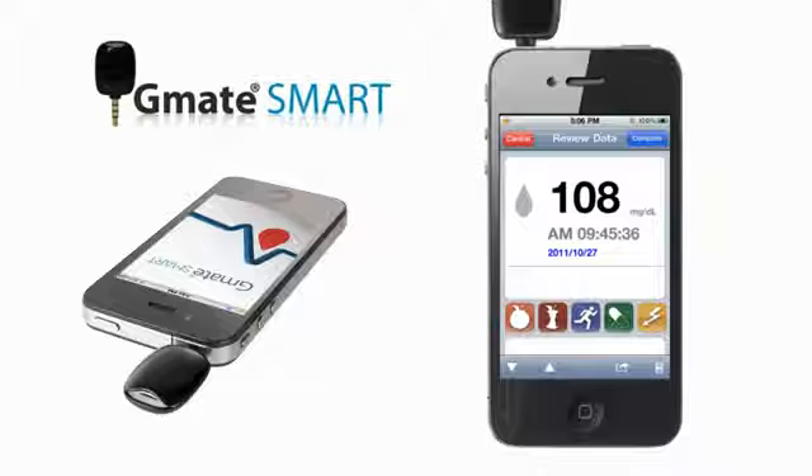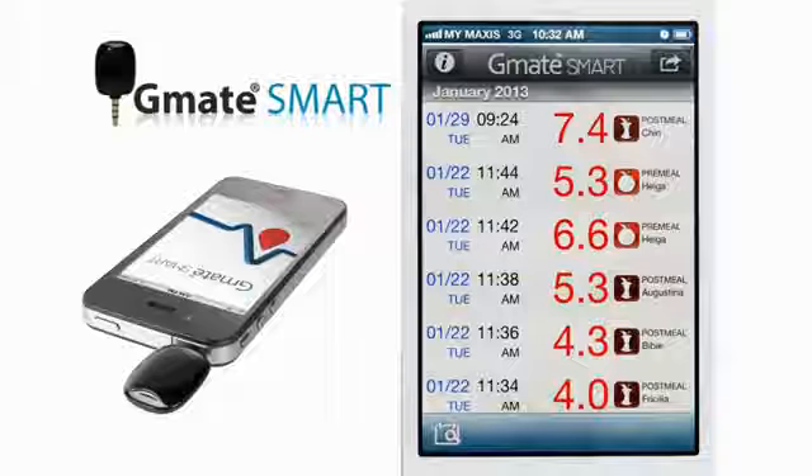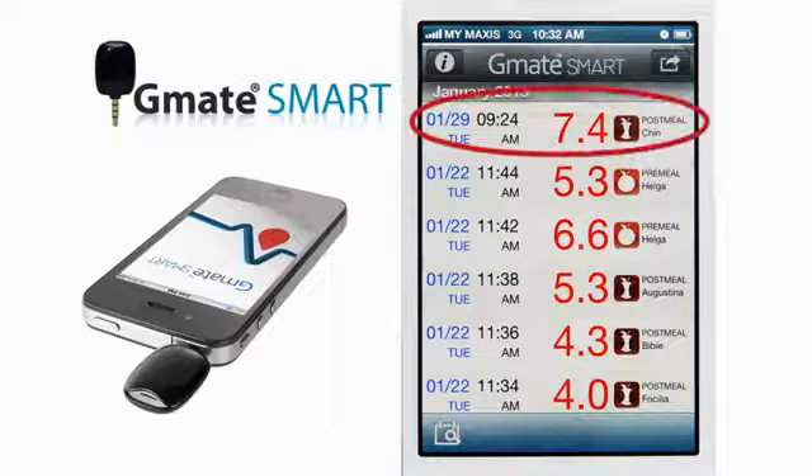The test results measured by the G-Mate Smart system are stored in your smartphone. You can review your test results whether or not your G-Mate Smart meter is connected to the smartphone. Touch the G-Mate Smart application icon on your smartphone. The test results will display as a list, with the most recently measured result displayed at the top of the screen.